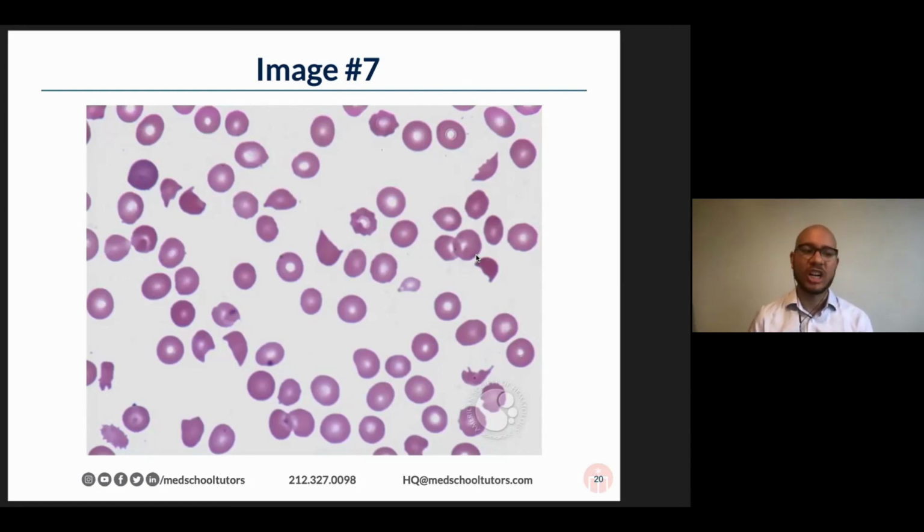But when I say the word schistocytes, go ahead and put in the chat, what are some of the diseases that you associate with schistocytes? Someone put in hemolytic uremic syndrome. That's absolutely right. That falls under the broader bucket of microangiopathic hemolytic anemias, which includes both HUS as well as TTP, as well as DIC. Beautiful. And folks are also pointing out that there's combos. You can see schistocytes in combination with, for instance, an eclampsia picture, maybe some liver dysfunction, and you end up with HELLP syndrome. That's absolutely right.